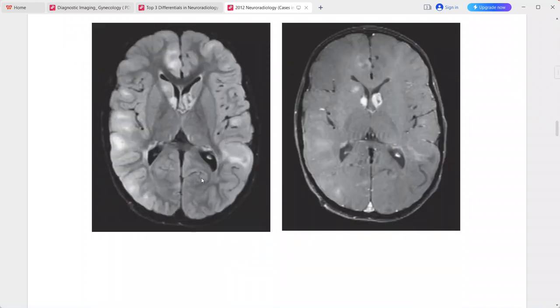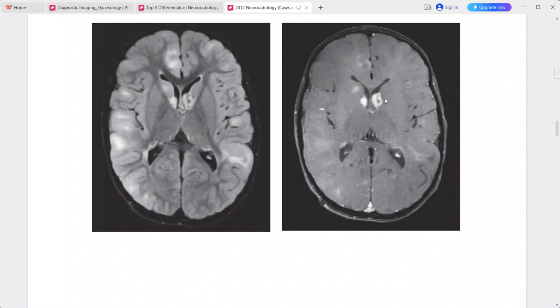FLAIR shows numerous areas of cortical and subcortical high signal intensity. Post-contrast shows enhancing nodular masses near the foramina of Monro bilaterally. These are the typical imaging descriptions of tuberous sclerosis. Differentials include congenital infections (TORCH) and multiple subependymal grey matter heterotopias, though they do not calcify.